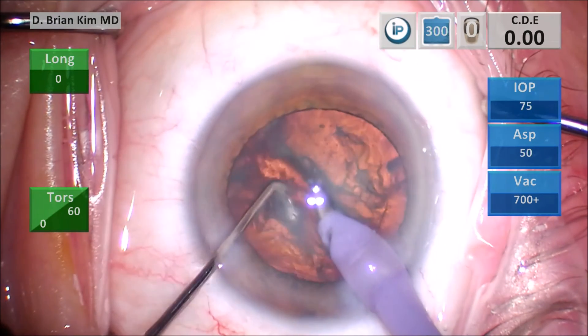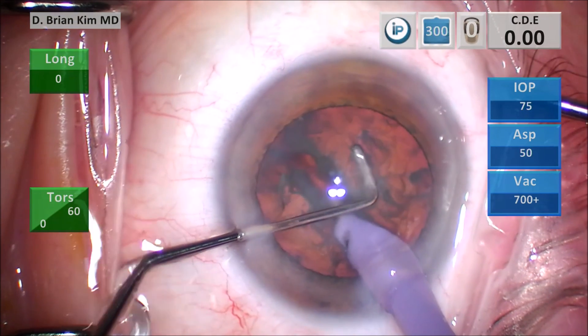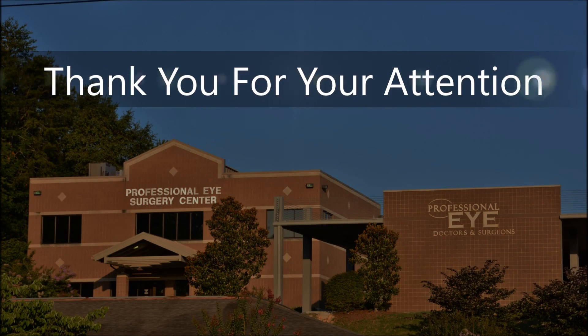I hope you understand why this technique is more effective and more versatile under a variety of situations — mechanically fracturing the lens with support from below and above. Thank you for your attention.